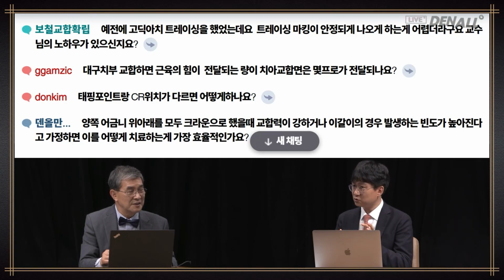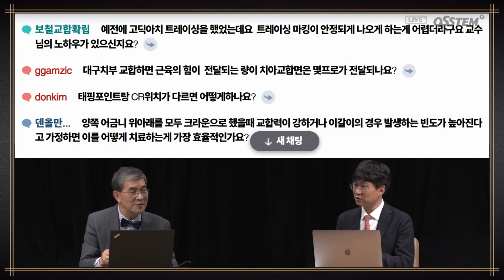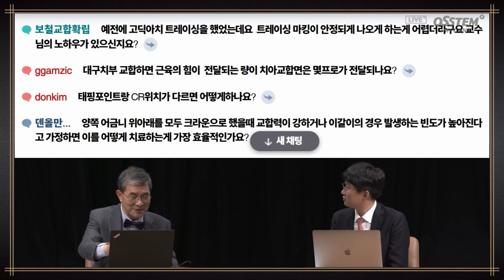So it requires exercise. Yes, when I let patients do the movements, and in the meanwhile, I see other patients and I can see the tracing works very well. So I would appreciate it if you take another opportunity to explain the know-how or tips to make a Gothic arch tracing marking appear very well.